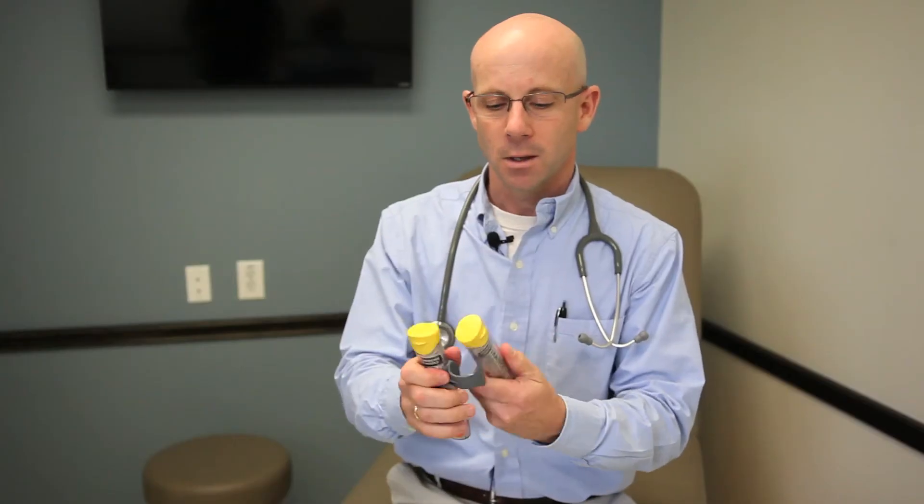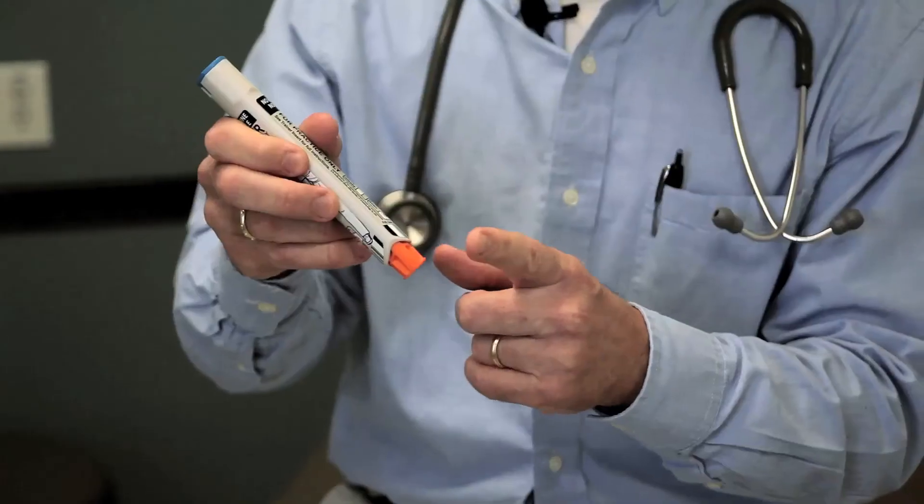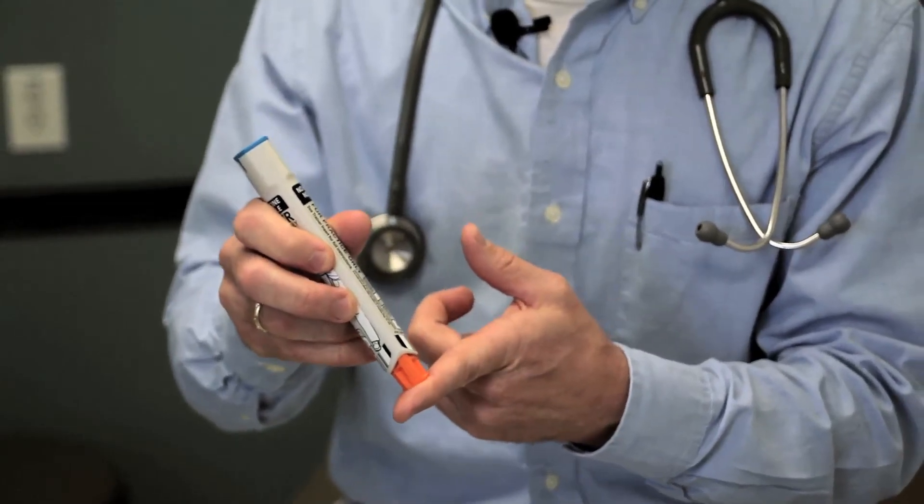The other epinephrine injector is called EpiPen. This one is in a hard case and they're going to come in pairs like this. You pop it out — it's still in its case, still safe, it's not going to do anything to you. It's got a safety at one end — the blue end — and this is going to be the business end, as I would call it.